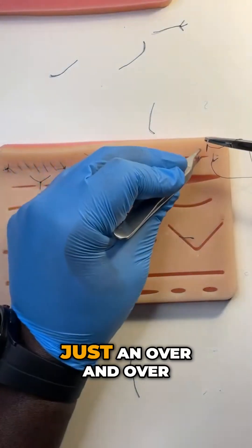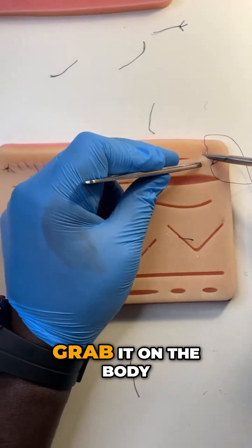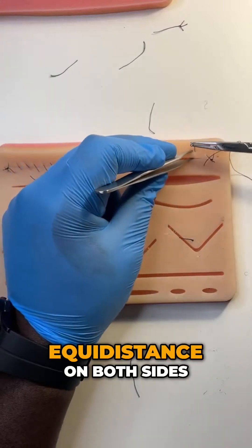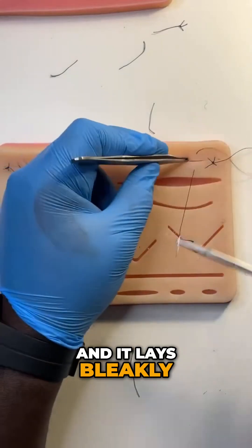And that essentially is just an over and over. But you need to be able to do it fast. So push it through, grab it on the body, mount it straight away, and you keep going. Equidistant on both sides. Go straight across.